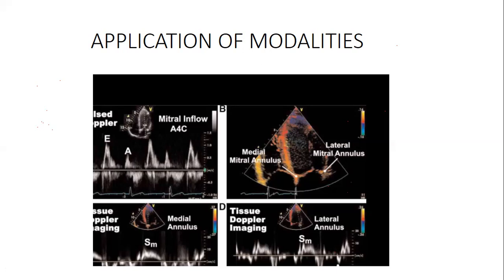Put that in your mind. It may come in your test. And then you also have, we are still doing tissue Doppler. Also, this is tissue Doppler. So this is how you can apply them.